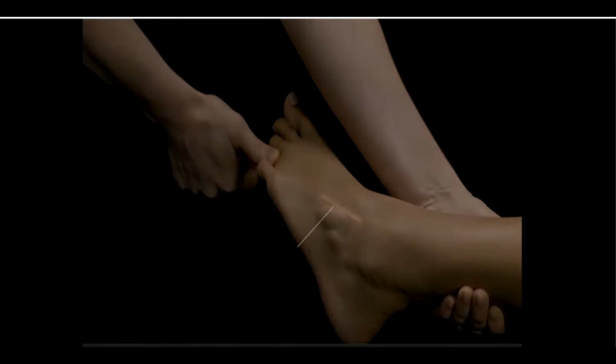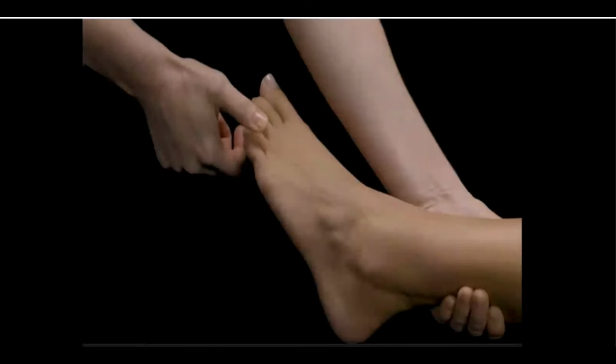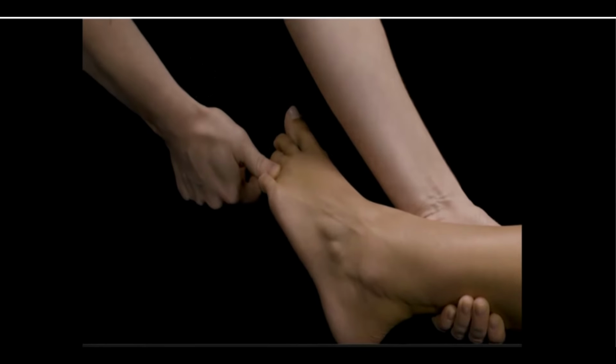Branches of the superficial peroneal nerve, or SPN, are usually visible with inversion of the foot and plantar flexion of the fourth toe. But keep in mind, the nerve moves laterally in the neutral position. This is important to note, as the SPN can move as the portal is being created, depending on where the ankle is positioned.